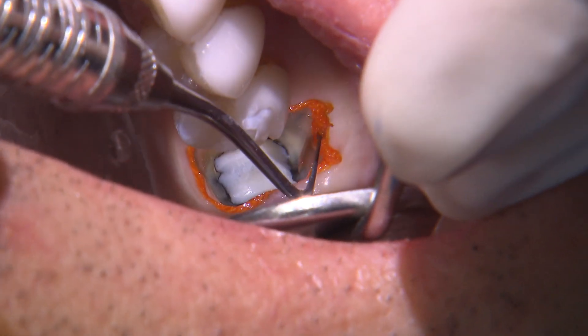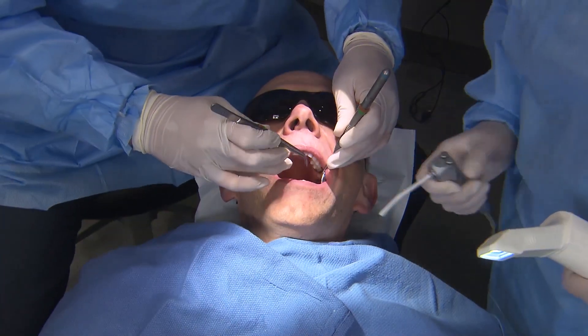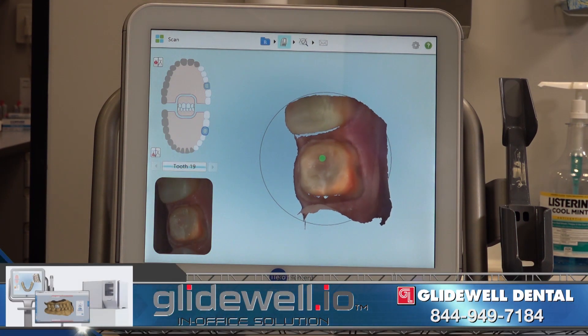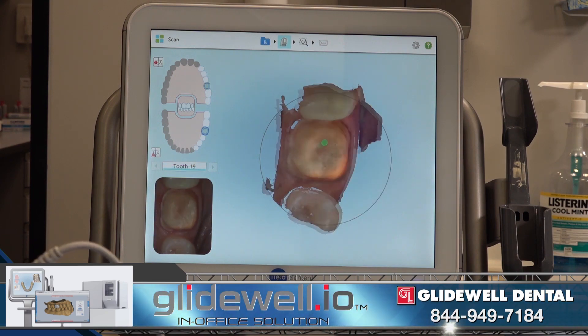After having set for several minutes, I remove the retraction cord from the lower molar to expose the space between the prep and tissue, which is exactly what we want for an accurate impression. Once the cord is removed, we dry the site very well and begin our digital impression with the iTero Element.